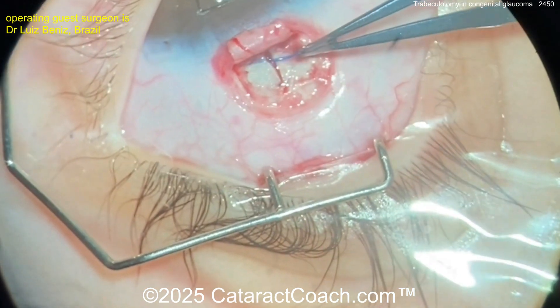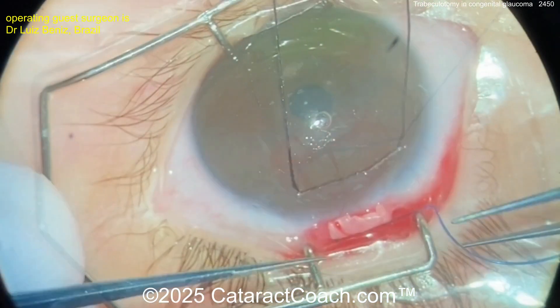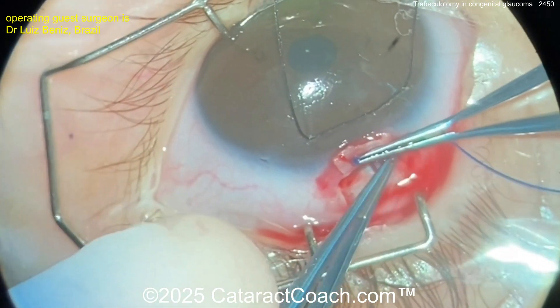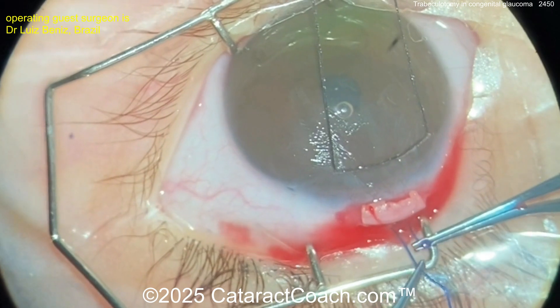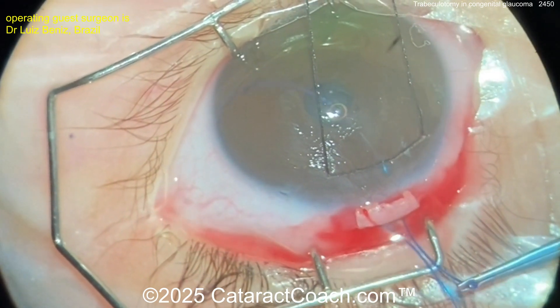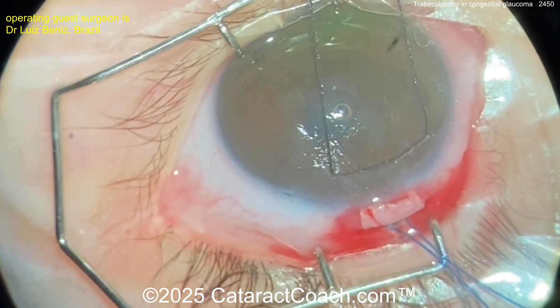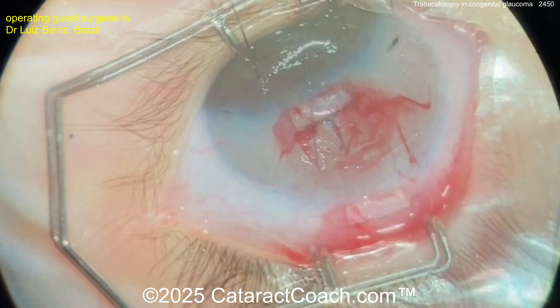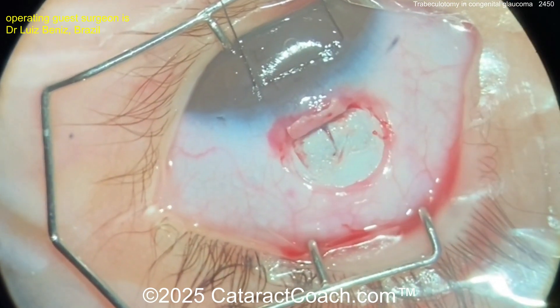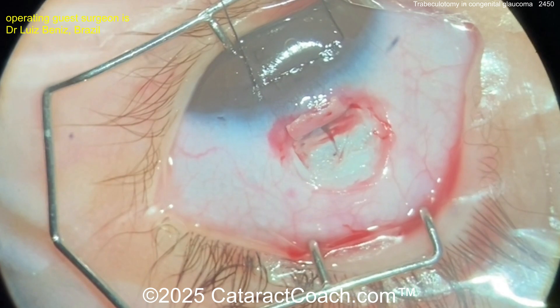This surgery was so smart — a kink was placed in the suture at the completion of going around 360 degrees. I'm watching this video for the first time — there's that kink, there it is! Fantastic. Pull the two ends through, and now pull across and you will unroof it 360 degrees. The suture comes across — beautifully done. There are other devices that can work here as well, but I really like this suture technique.